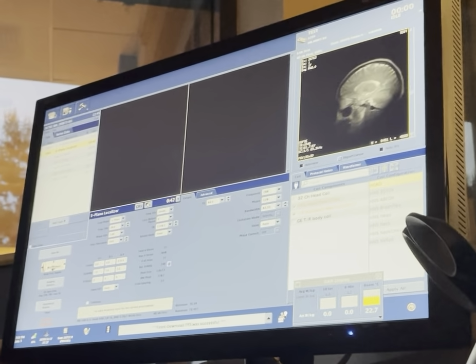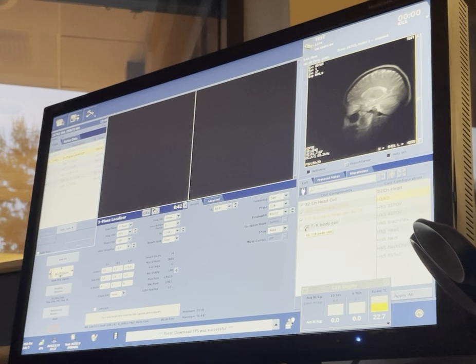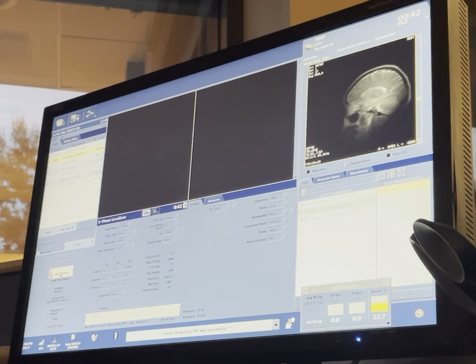Click on that. What does it say over there? Click on that one, and then click the 32 channel head on the right. Yeah, let's try that. Now scan and save and scan. Let's hope this is.